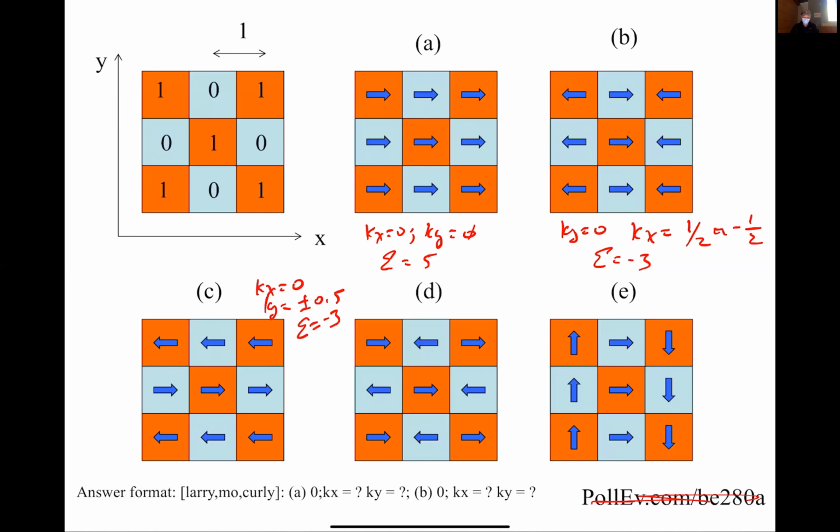All right, how about D? Where are we in K space here? Once again, 0.5, right? And KY is the same thing, right? And what's the vector sum here? Yeah. That's pretty big, right? Because it's the largest we've had so far. You can sort of see how that spatial pattern is matching my object pretty well, right?